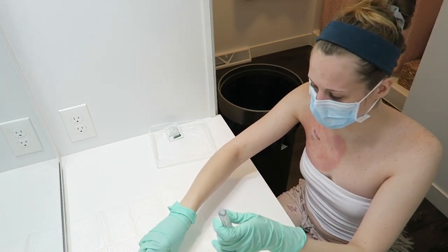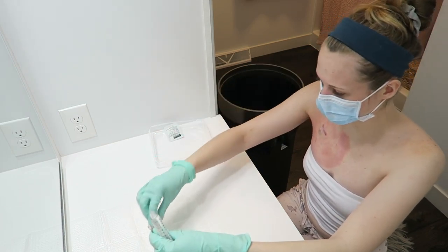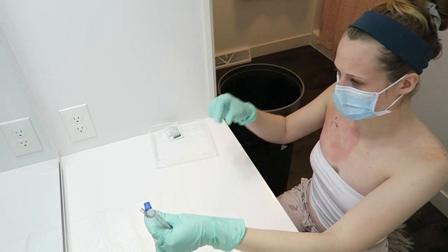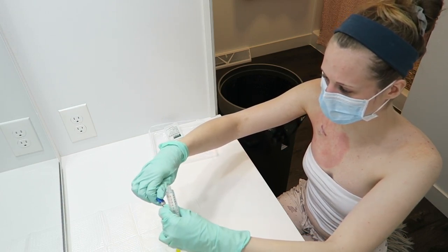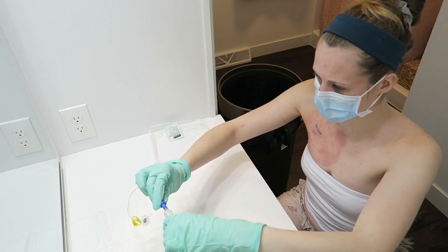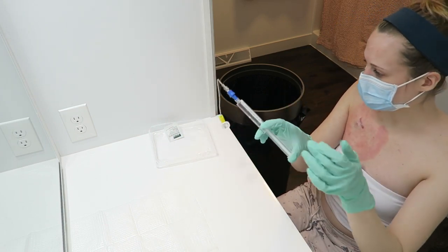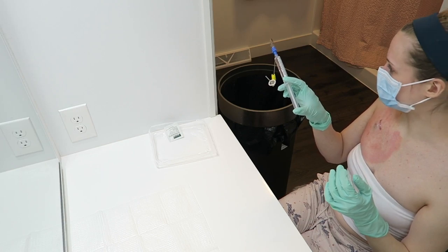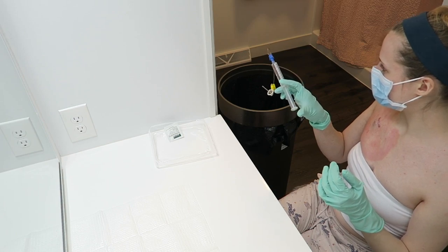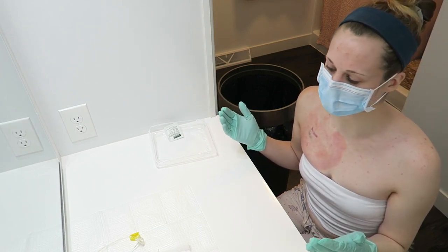This is primed. We're going to go ahead and take our needle, take the end off of the tubing, take the end off of the clave connector, and put the clave connector onto the needle. Then we're going to put the clave connector on the syringe and twist. And now we're going to go ahead and prime the needle. Basically, I'm just pushing water through it so that there's no air left. And I wait for a couple of drips to come out. Then I can go ahead and set this back onto the sterile field. And now we are ready to put the needle in.